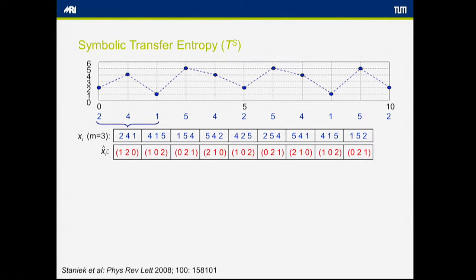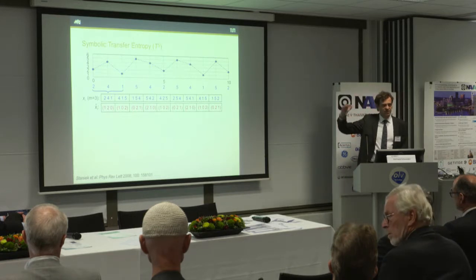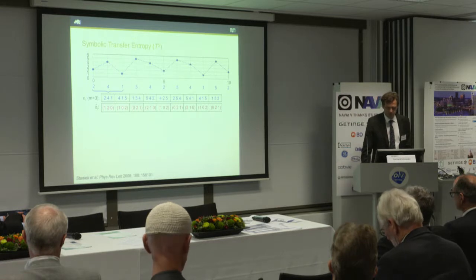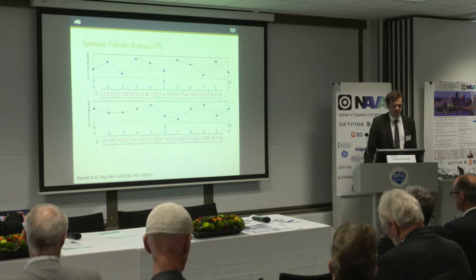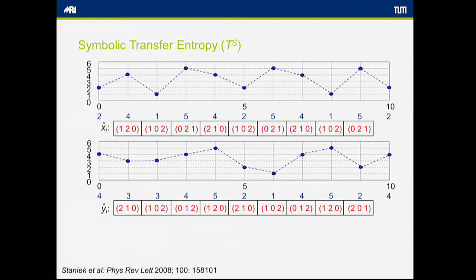Simultaneously, we looked at the EEG data and we applied a specific method called symbolic transfer entropy. Symbolic transfer entropy does a sort of normalization to the EEG. It looks at the EEG as a number of changes in direction, and you induce symbols for that. You can do this with one channel, or with more than one EEG channel.